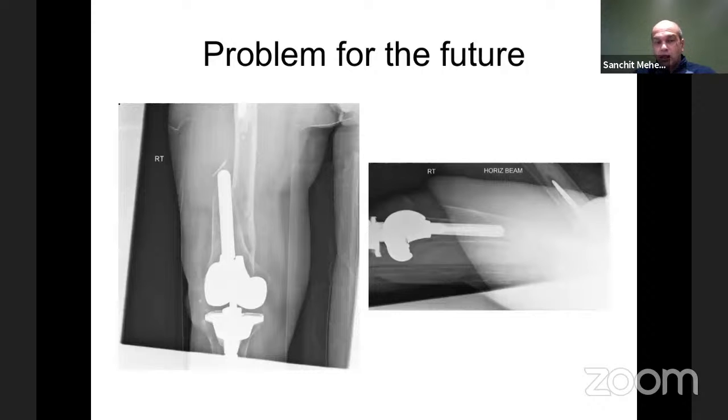In these cases, something like the Zimmer plates or the Periop type, the Smith and Nephew plating system is quite handy, that you span the whole bone, you get some fixation, but if you can get a dual plate fixation, that is ideal in these cases. Further down the line, if you can't get any fixation, or if there's any combination, unfortunately, the solution has to be a total femur.